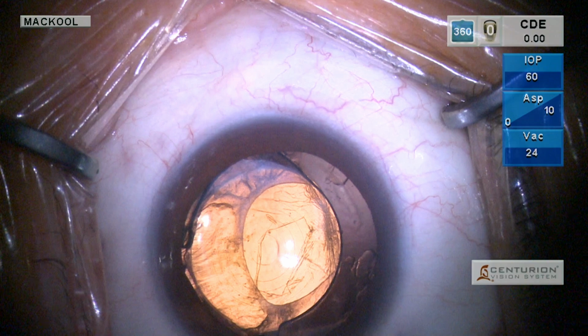You can see the central one. The second ring disappears beneath the inferior opaque anterior capsule. So we may have our work cut out for ourselves, and we might have to resort to IOL exchange. So we have an implant ready should we be unable to satisfactorily recenter and keep this lens well fixated.